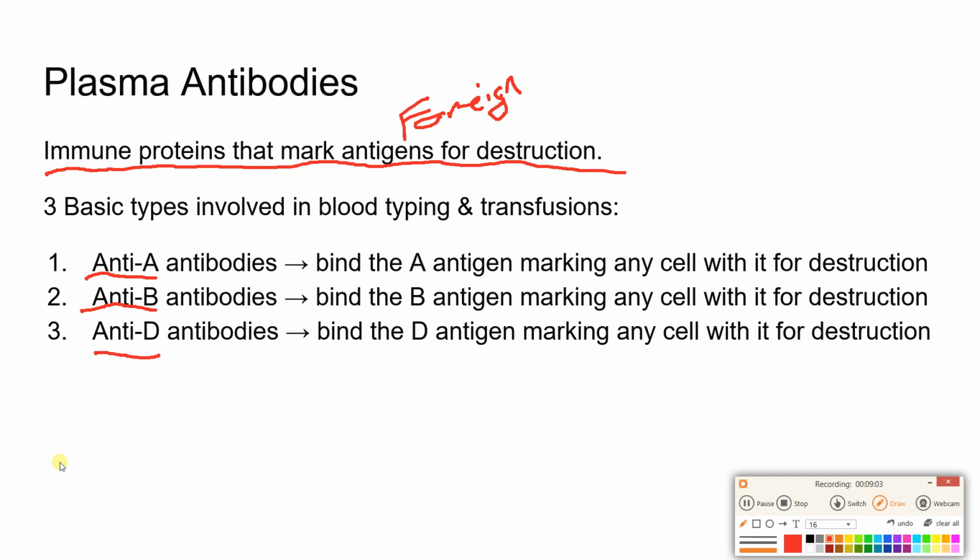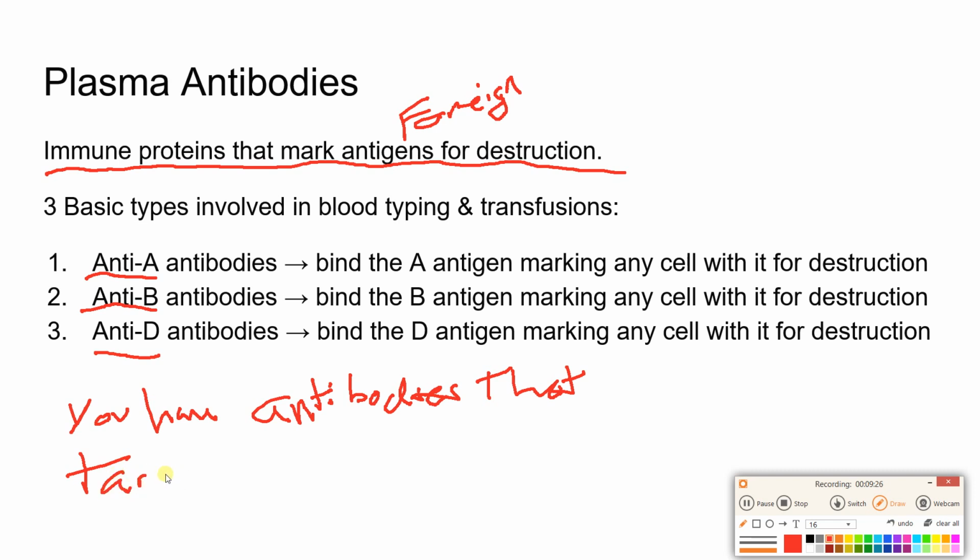So a good rule of thumb is that you have antibodies that target the antigens you lack.